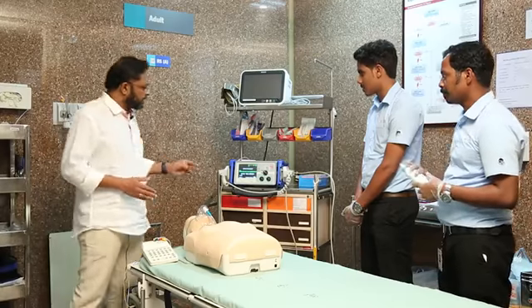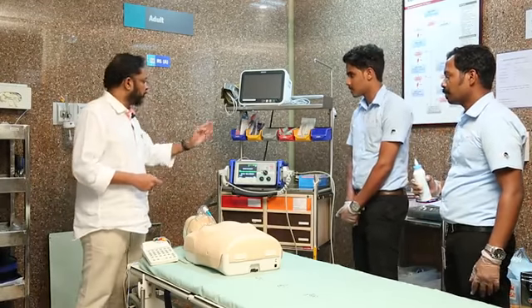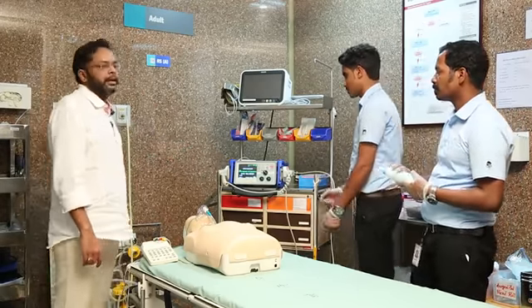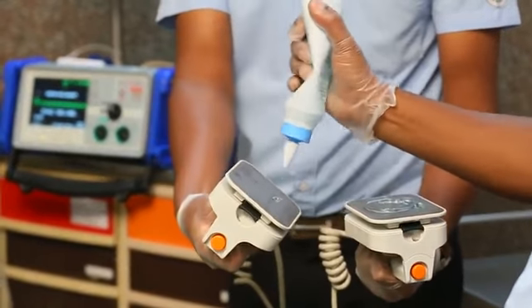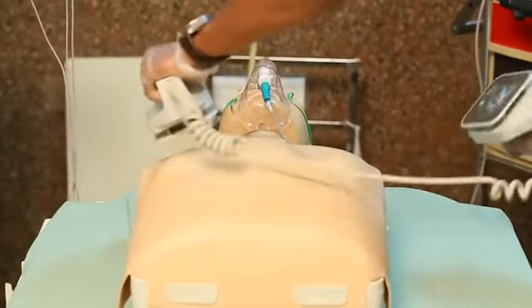The idea of synchronization is to avoid the shock falling in the vulnerable period of the cardiac cycle. If it falls on the vulnerable period, it can cause a malignant rhythm like VF or VT. So, after synchronization, sedation and consent, we take the paddles, apply gel, and place the paddles, one on the right side and one on the left side of the heart.